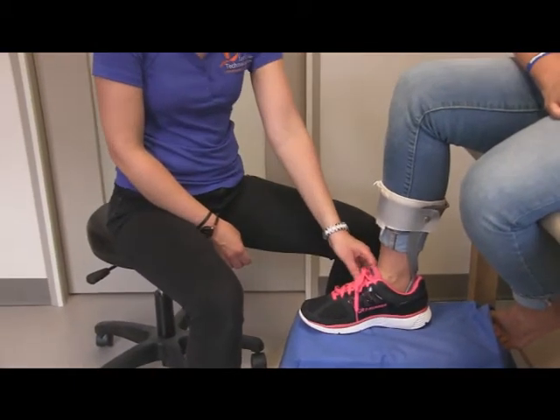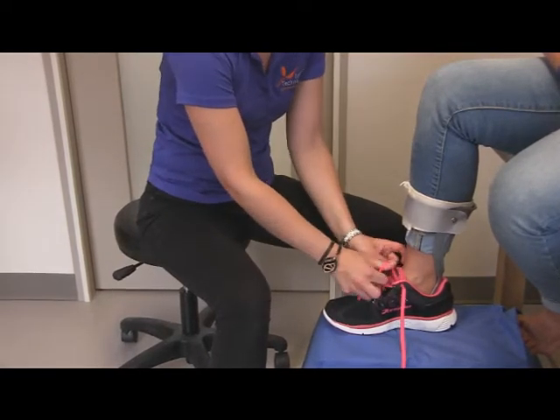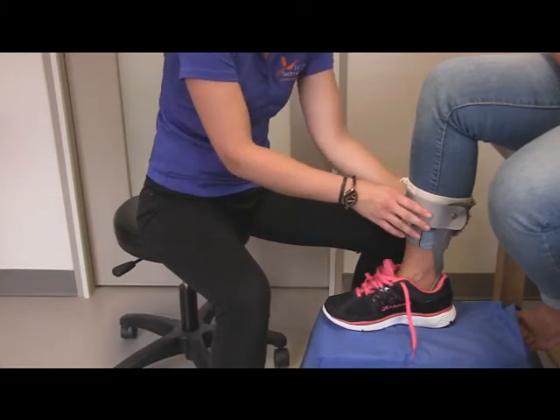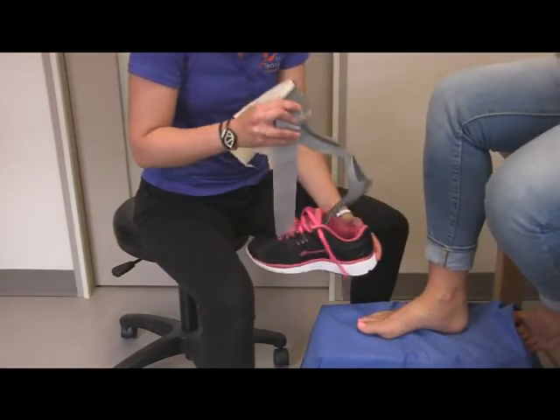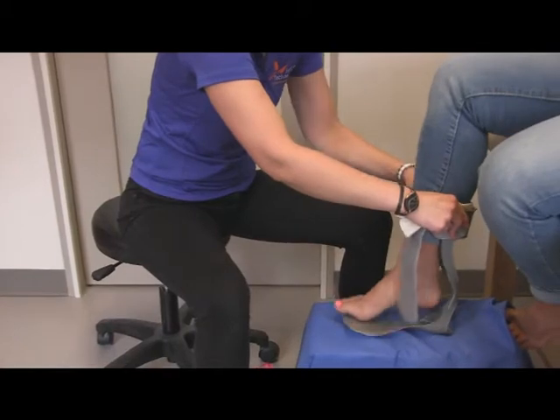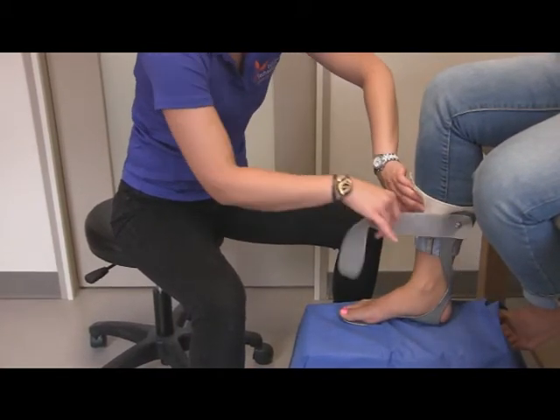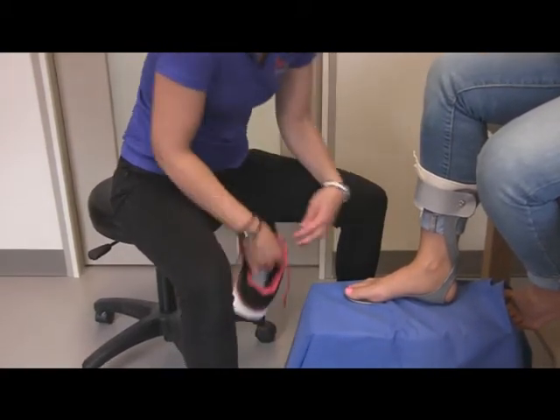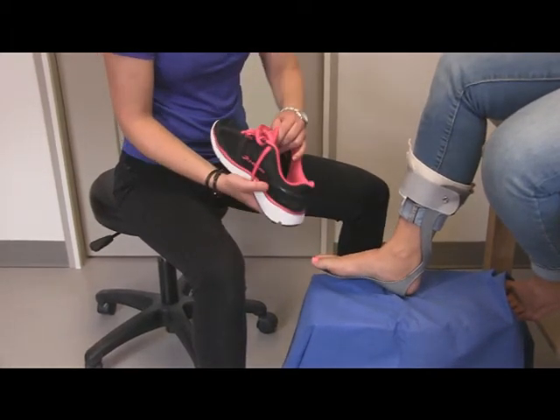If you'd like to place your foot on the brace first, or if it is too difficult to align your toes to slide into the shoe with the brace already in there, you'll want to place your foot on the brace first. Secure the calf strap, and again, loosen the shoe laces and open up the tongue.